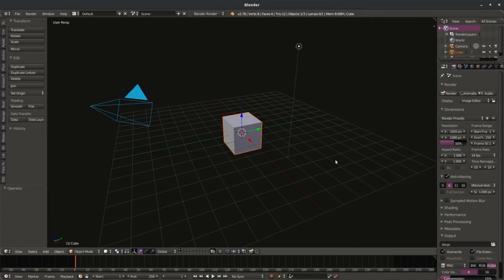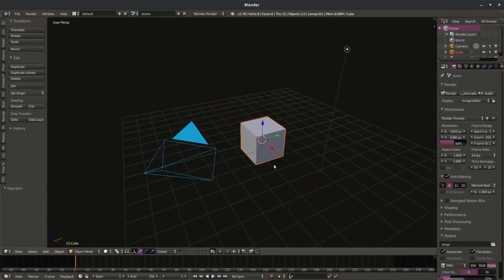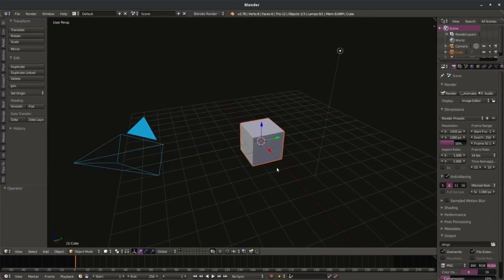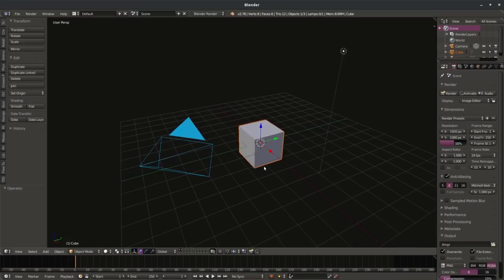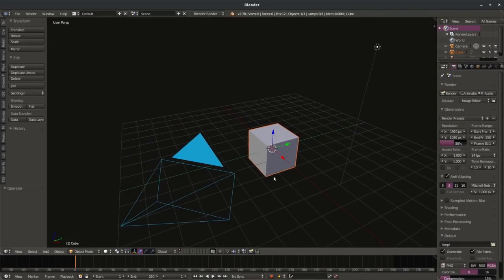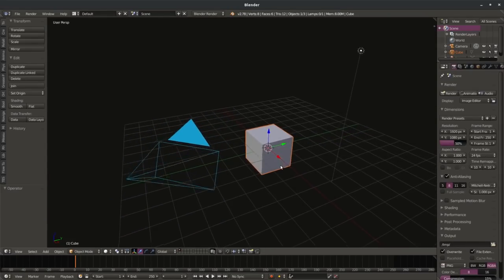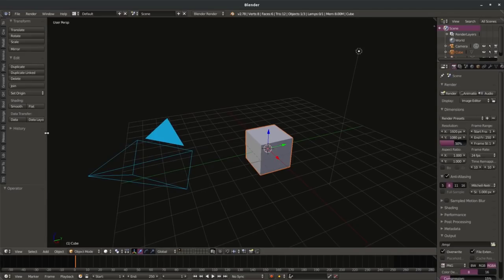I'm a 3D designer and I will try to explain you how OrtogOnBlender add-on works. I don't speak English very well, but we decided to create this material because a lot of people around the world started to send emails for us asking about how the add-on works.